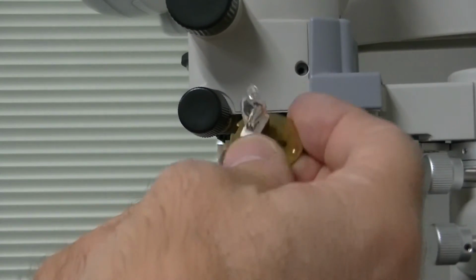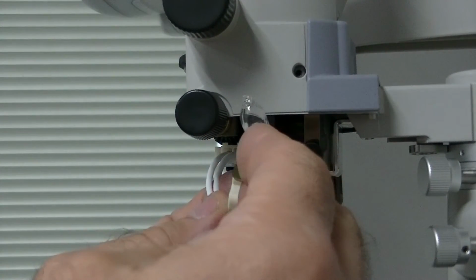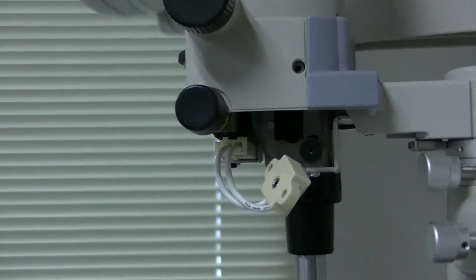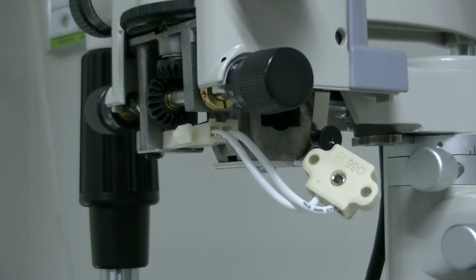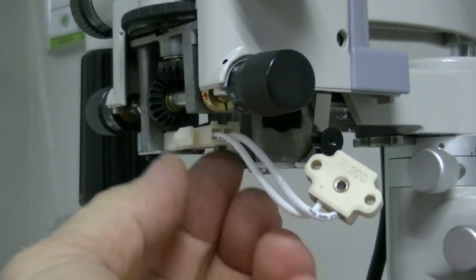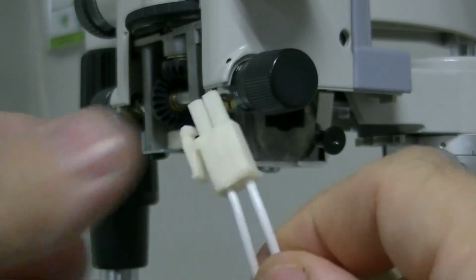Now, sometimes the bulb may go out, but it may not go out. It might still go out, but it's the lamp socket that's bad, but the bulb actually isn't bad. So what you have to do to replace that, you swing it around over here on this side. What you have to do to replace that is the following. It goes into a Molex connector. That's what that's called, a Molex connector. And there's a little tab right here, and you squeeze on that tab and you pull out like this, and that whole thing will come out.